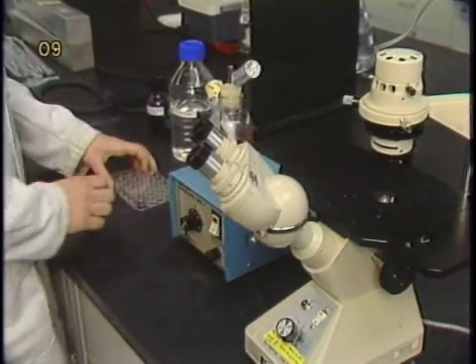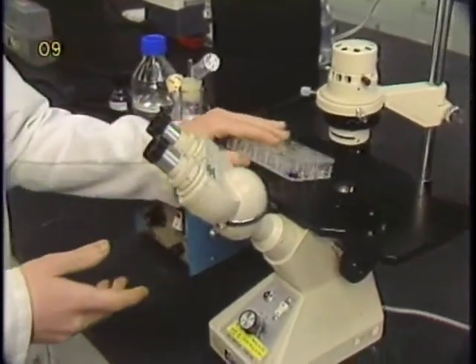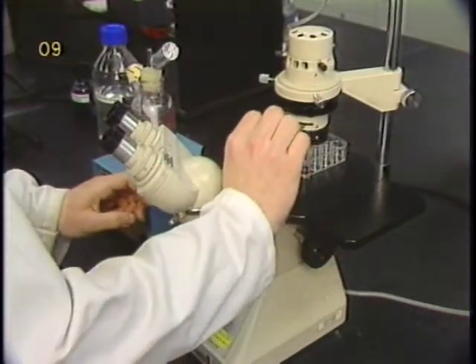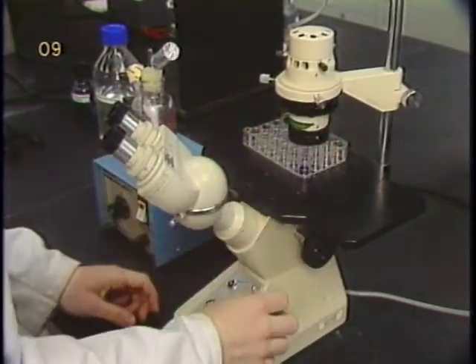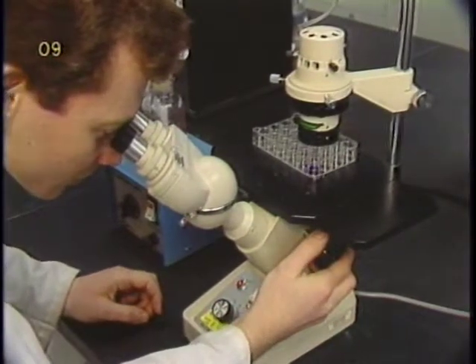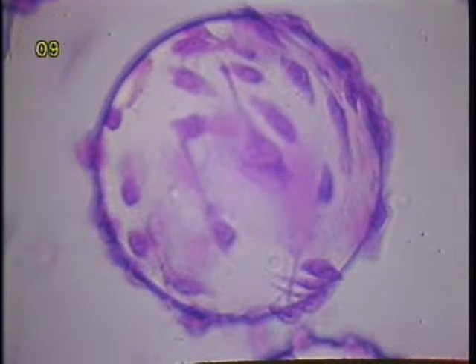The morphology of cells on microcarriers varies widely with cell strain and even with individual clones. Even for the same strain, the morphology may also differ when cells are cultivated on different types of microcarriers. Normal diploid fibroblasts, such as human foreskin cells FS4, readily spread out once they attach to microcarriers.